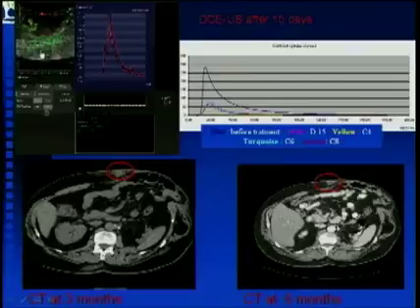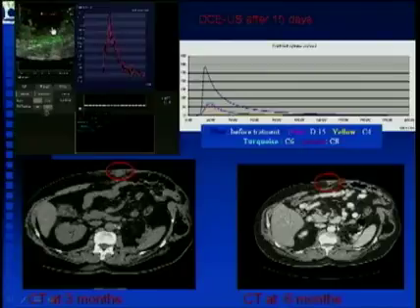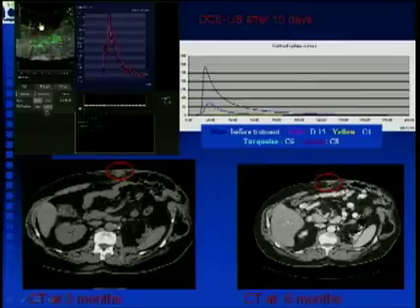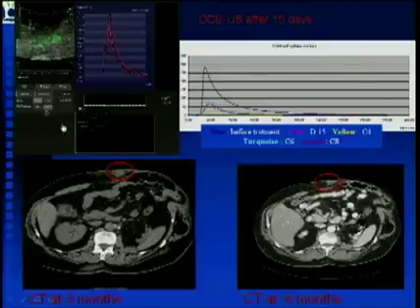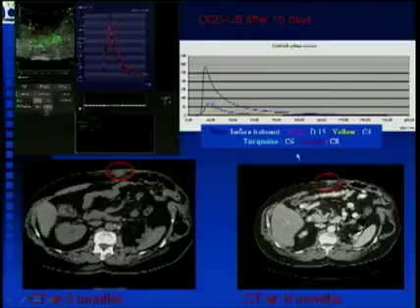In fact, if you use the morphologic analysis, I could perform the biopsy in different areas. And remember, if you don't have more than 30% of viable cells, you could discard your biopsy. But finally, if you use the SonoVue, you immediately target this area in order to have a very high quality of the tissue. And in fact, this patient had a very nice answer because he had partial response after 3 months and 6 months. And remember, only 15 to 20% had partial response.